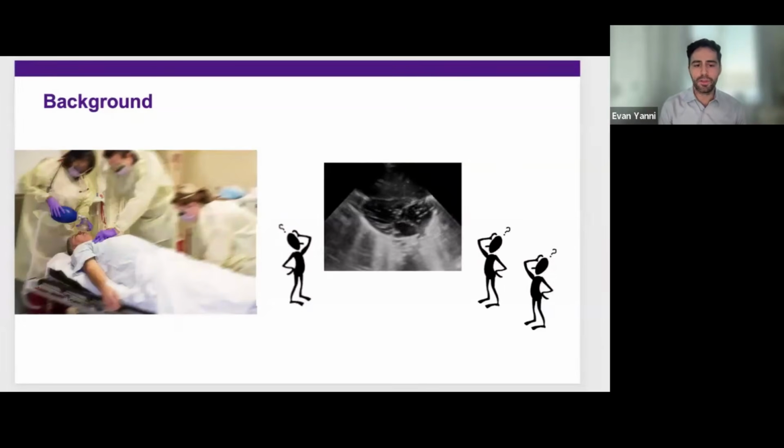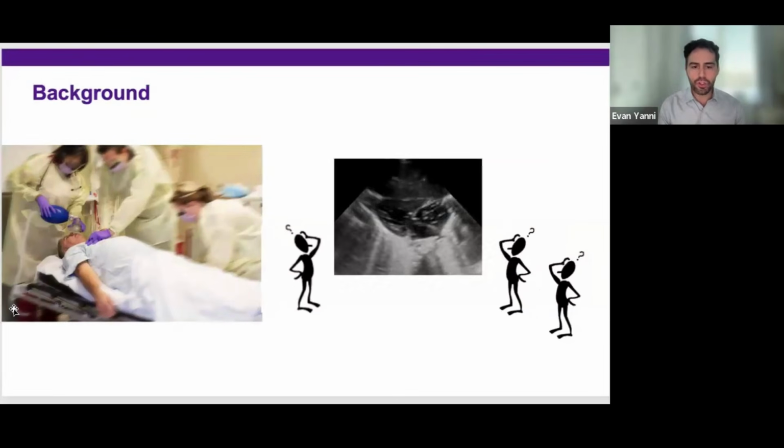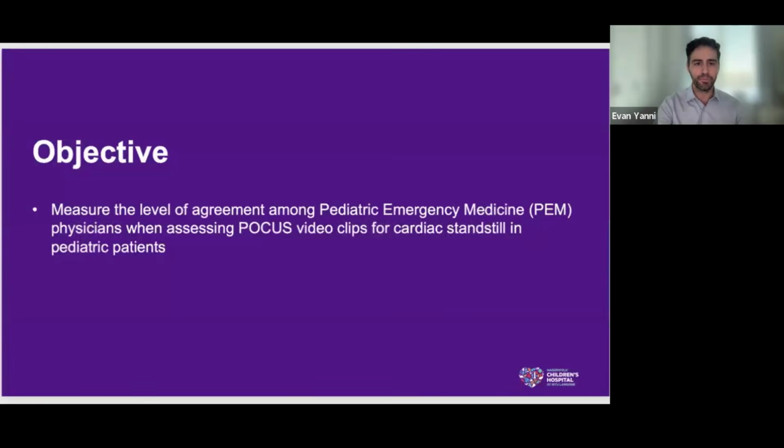So, for example, some definitions include both the myocardium and the valves, whereas others say standstill only refers to the myocardium and allows for isolated valve movement, for example. And it does have further discrepancies as well, depending on the study that you're looking at. And then also, there are adult studies that only show moderate agreement on what represents standstill.